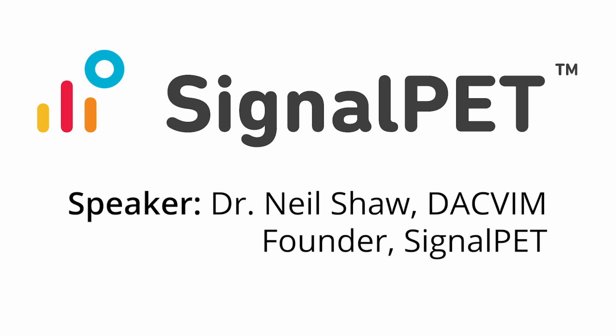Thank you. So guys, just as a recap, the first part of the presentation was the assistive technology, utilizing software and AI to provide a second set of eyes to your routine radiographs. So that as your radiographs are taken, within minutes you are looking at assistance and predictions on what's on the radiographs at the same time that you're first looking at them, which is, excuse me for saying, very cool. It's great. And again, it happens automatically and within minutes.